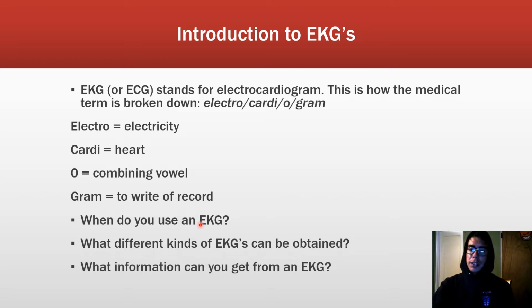You can see that on an EKG. You can identify hemorrhagic strokes, where a blood vessel in the brain ruptured and they have increasing cranial pressure. You can identify hypothermia, pulmonary embolisms, which are blood clots in the lungs, and certain conditions with abnormal electrical pathways that aren't usually there, that cause a different flow of electricity.